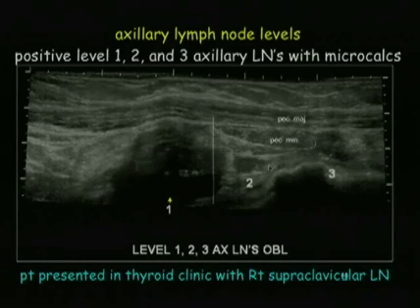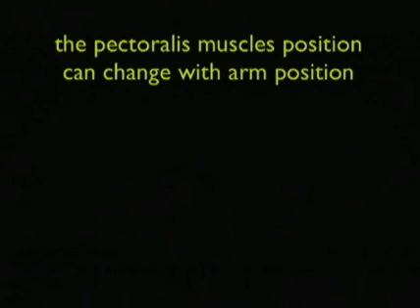Here's a level 2 node with microcalcifications lying directly behind the pec minor, and this white line shows the border between level 1 and level 2. And here's a level 3 lymph node with microcalcification. So this is metastatic disease of the breast that presented with a supraclavicular node with microcalcifications, but this is a nice outline of the lymph node levels.